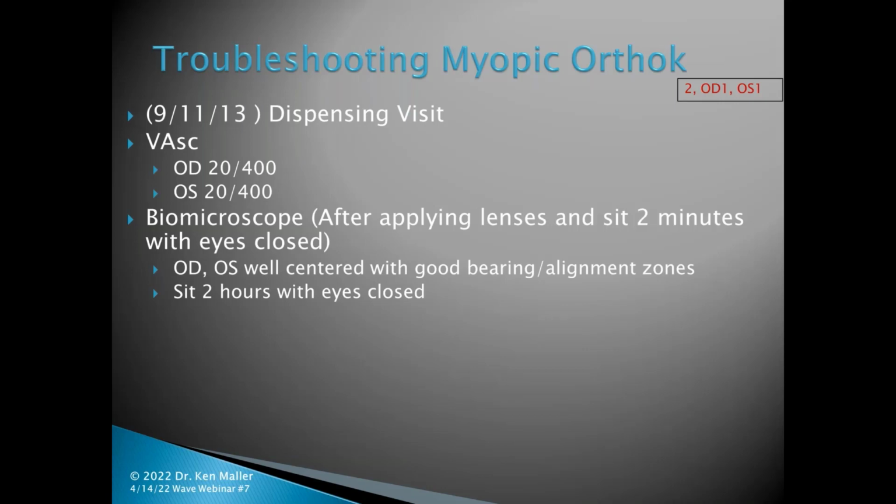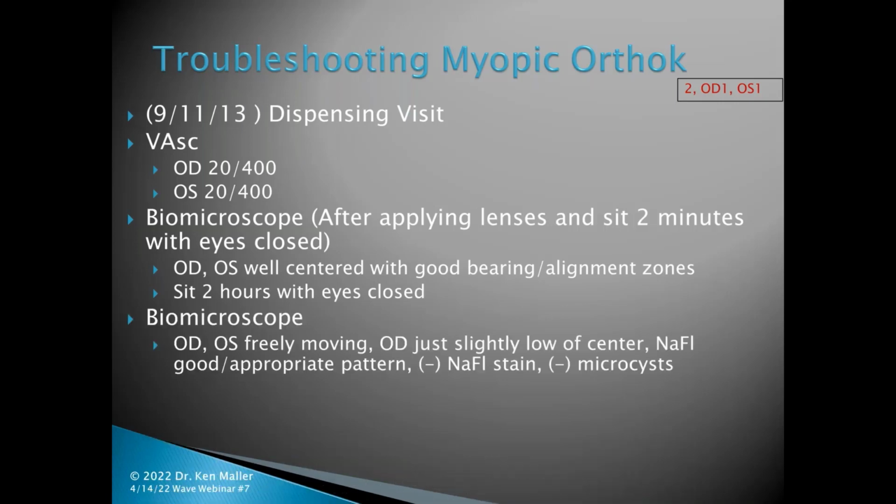The right and left look both well centered with good bearing and alignment zones. I then will bring them into another room to lay down, basically in a recliner chair, for 2 hours with his eyes closed. Some of the kids will actually go to sleep during that time. I then brought him back into the exam room 2 hours later.